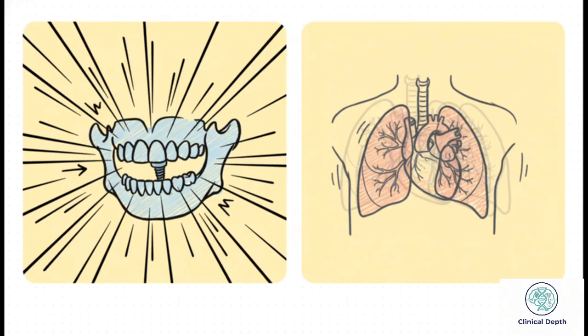It really boils down to two key things. First, metal. Stuff like surgical implants, dental work, pacemakers. They're so incredibly dense, they just completely overwhelm the scanner and cause those wild streaks we saw earlier. And second, just plain old moving. If you move at all during the scan, even just breathing or your heart beating, it's like trying to take a photograph in the dark with a really slow shutter speed. You just get a big blur.